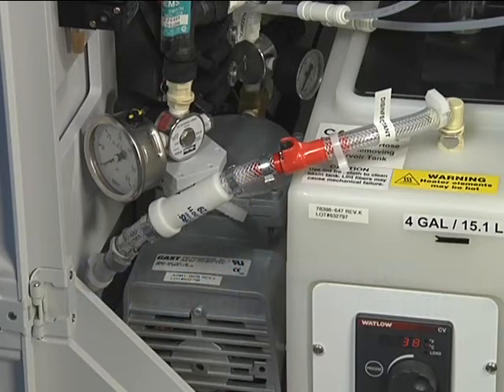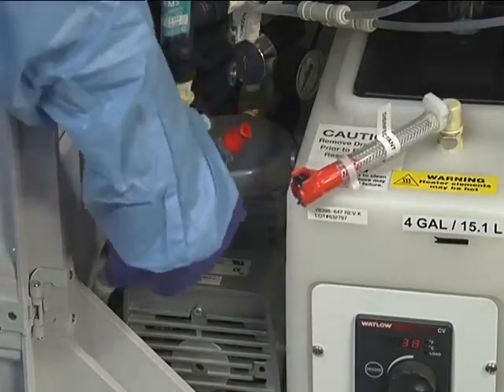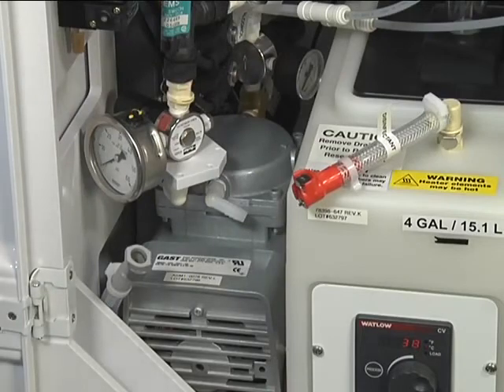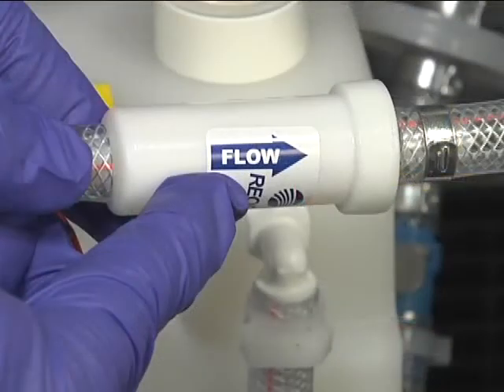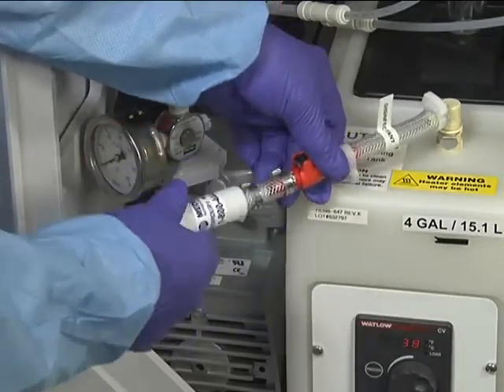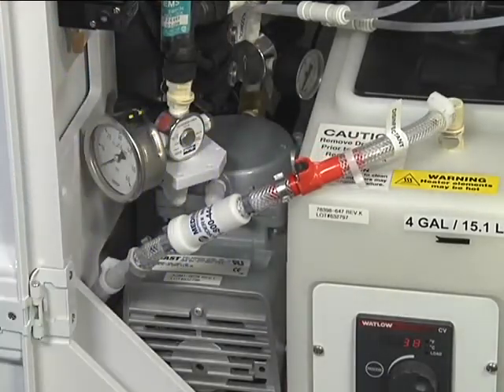Before changing the disinfectant filter, place an absorbent cloth under the filter connections to catch any remaining solution. Undo the quick-connect fitting from the reservoir side of the filter. While holding the filter, undo the quick-connect fitting from the pump side of the filter. The arrow on the filter, which indicates the direction of flow, should point towards the pump.